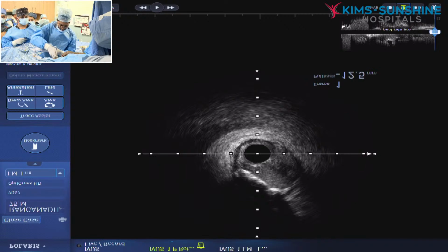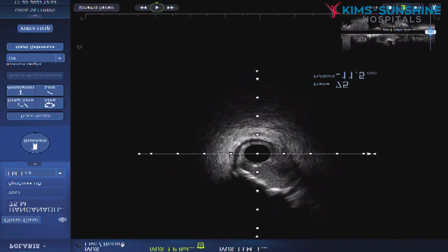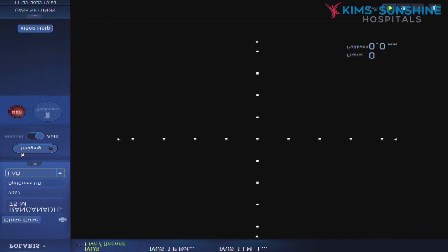Brother, on IVUS, who is looking after? Wait. Some error is coming. IVUS error. Ready, brother?